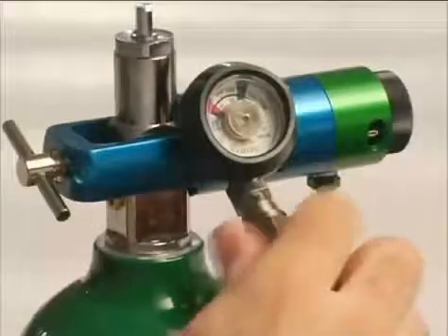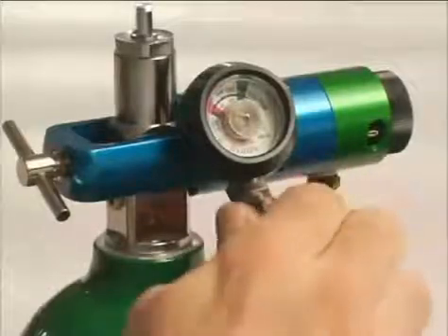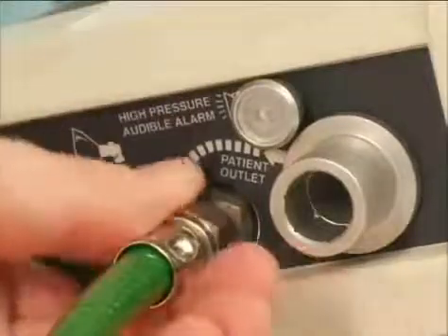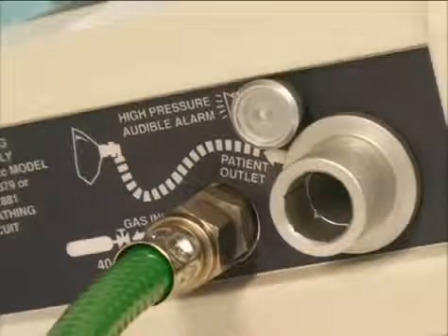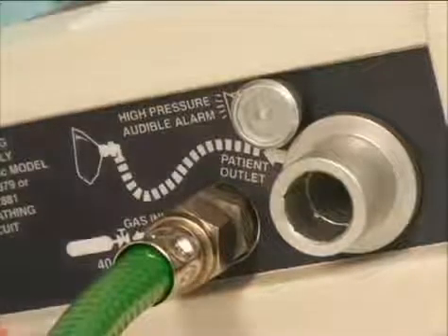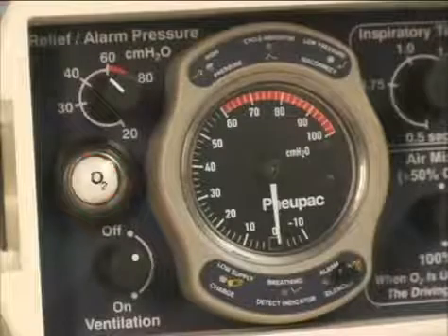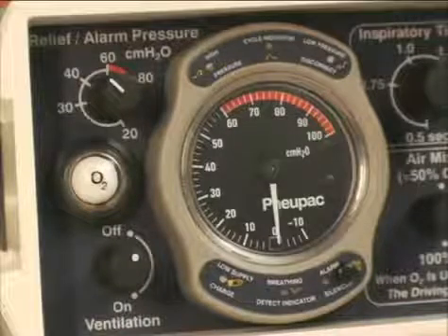To ventilate the patient, connect the high-pressure supply hose to the gas supply, then connect it to the gas inlet of the ventilator. For the ventilator to operate and cycle properly, do not use any less than 40 psi or any more than 87 psi for the high-pressure input. Then connect the patient circuit. If applicable, turn on the gas supply. Make sure the visual indicator for supply gas failure has changed from red to white.